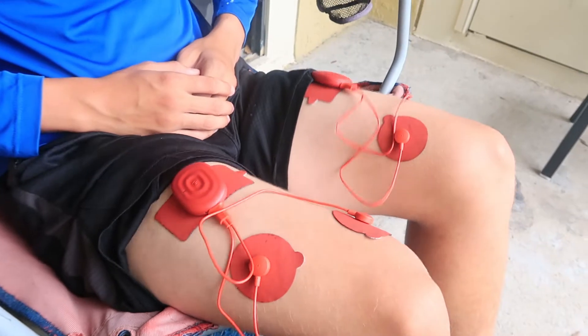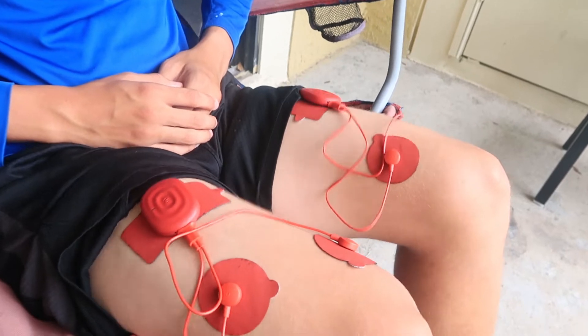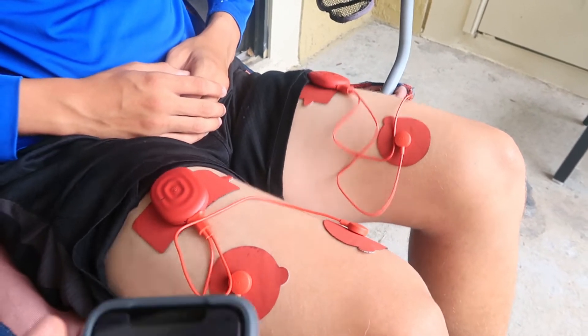During that whole 19 minutes, it's going to take him through different patterns of electrical stimulation that do different things to the muscles. That's why it's so good for me — because since I can't do it myself, this is doing it for me for now.